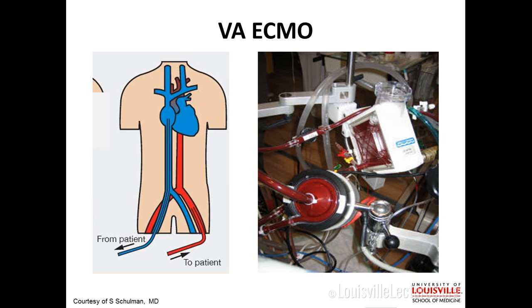I have a decent record. I had 1 week where I put 2 ladies on and they both survived, but that was really unusual. I've also used this for a massive PE that caused a woman to die, and when we got her back, her RV was so blown. So we put that woman on VA ECMO because then I was offloading her right heart and bypassing the entire circulation and oxygenating her while the heart got better, and that worked.